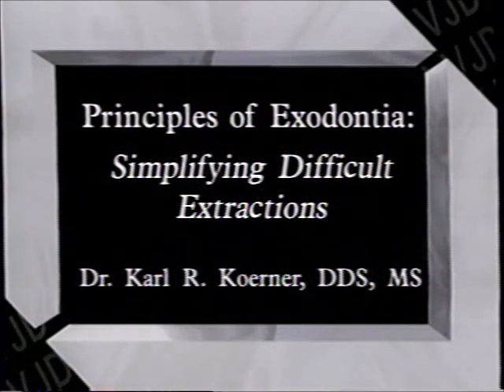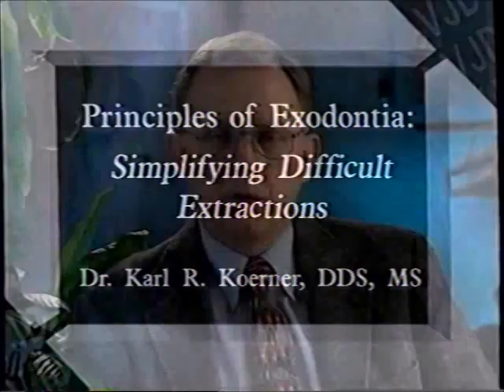It's a pleasure for me to join with the Video Journal of Dentistry to present this educational program on exodontia. We're going to talk about basic procedures, procedures traditionally done by general dentists in their offices. We're talking about taking out teeth, some of which are easy to get out, some of which are more difficult. Hopefully the things we discuss will make these procedures more comfortable for you to do, easier, and hopefully you'll be able to do them more quickly because of the principles that we cover.